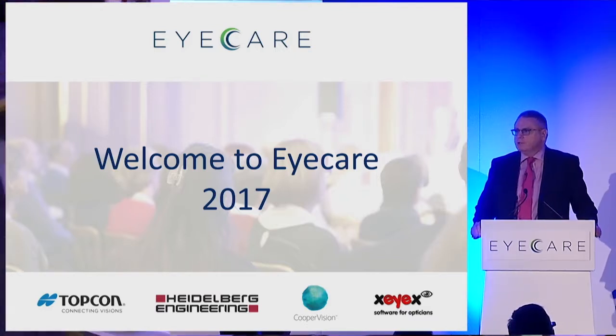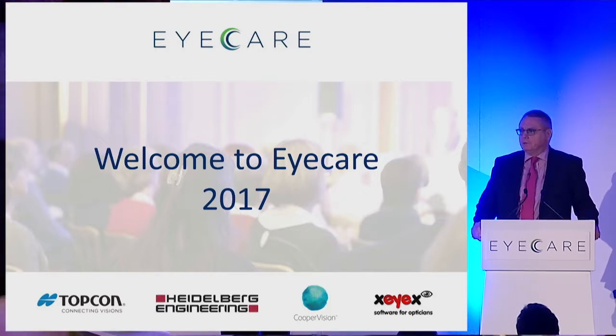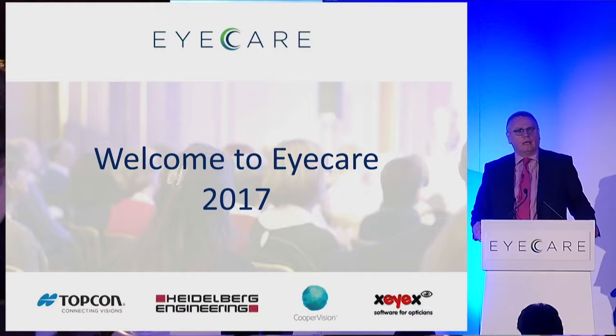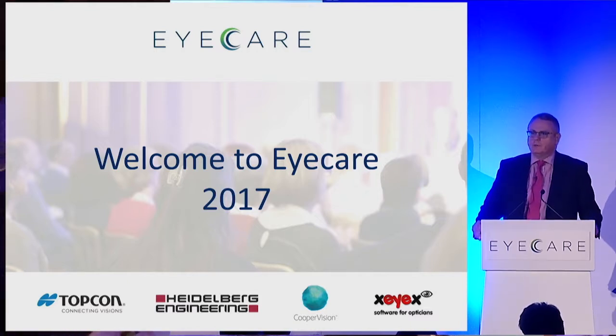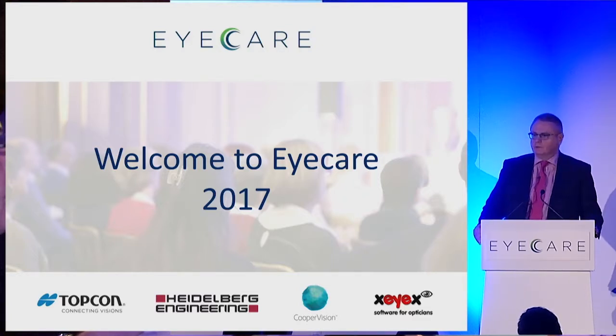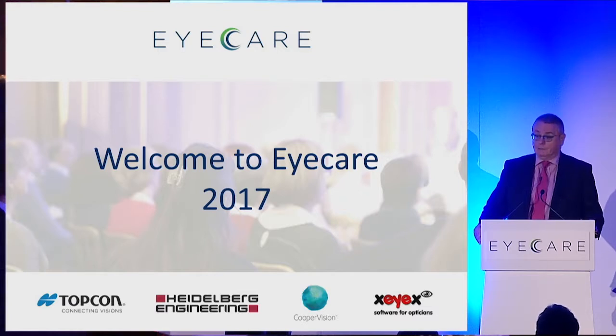Right. Good morning, ladies and gentlemen. Well, I'm truly astounded that we've got such a packed room today, so hopefully we can live up to expectations and deliver an interesting, informative and educational session. The title is OCT Live, and the reason we came up with this concept is that so many times we sit there and we discuss OCT images and people are reviewing them, and it seems very out of context. So we've been very kindly supported by a number of patient volunteers recruited by Dr. Gupta, and they've kindly volunteered to have their eyes scanned live.